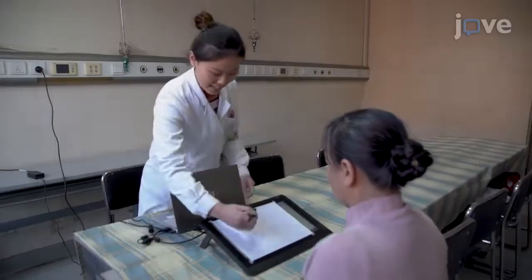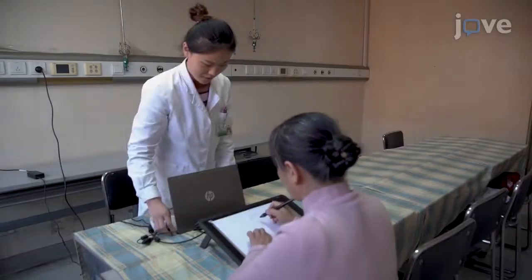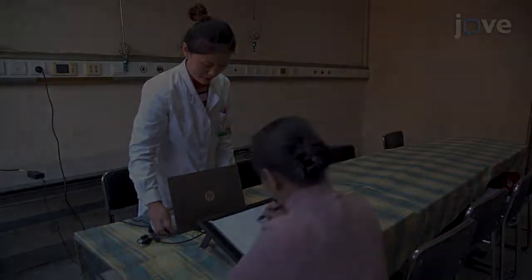To perform a handwriting task, use the stylus to create sample Chinese characters in the writing area of the digitizer.